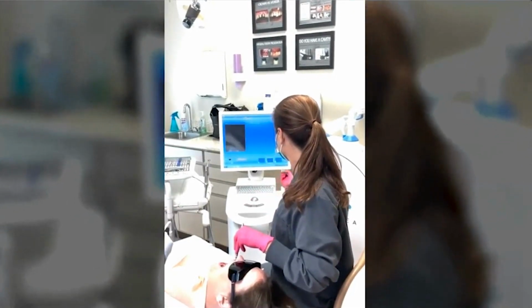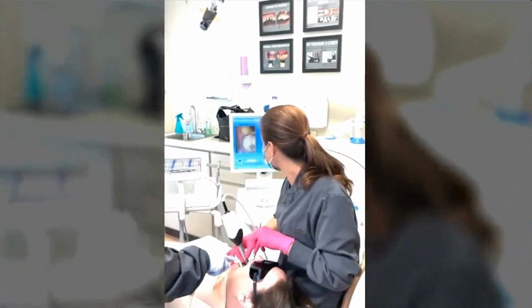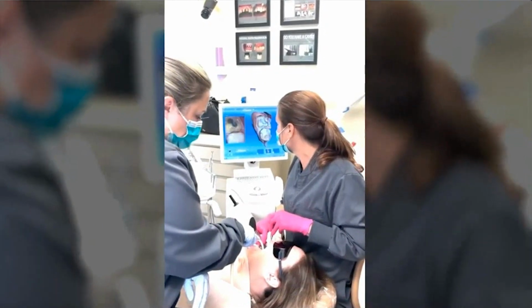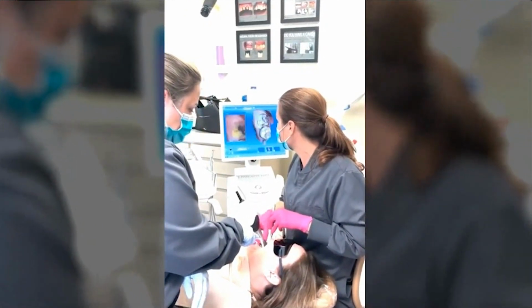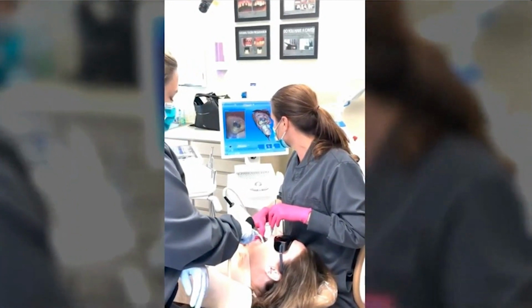So this is a video of me scanning a patient. The video is about a minute long. I do take a little extra time just so I can sit and talk through it, but we are doing a tooth number two, so it is a little far back, but as you can see, it's very easy.